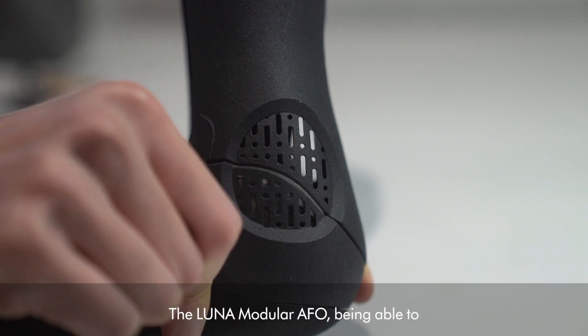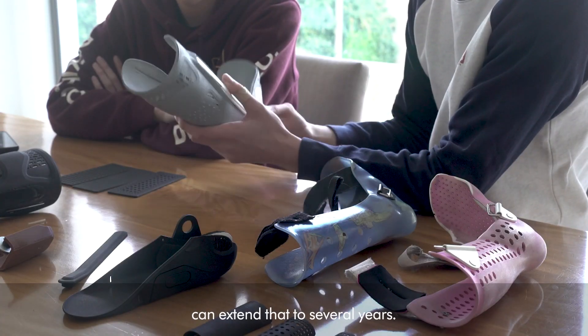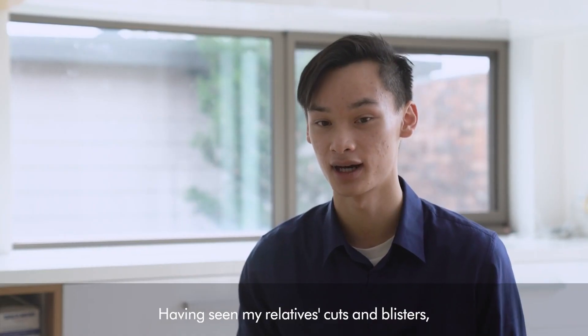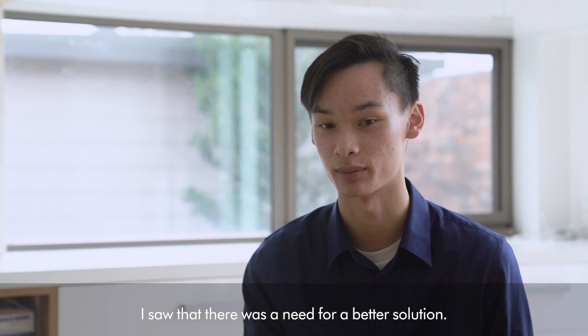The LUNA Modular AFO, being able to adapt and conform to users, can extend that to several years. I actually have two relatives with the condition, and having seen my relatives with cuts and blisters, I saw that there was a need for a better solution.